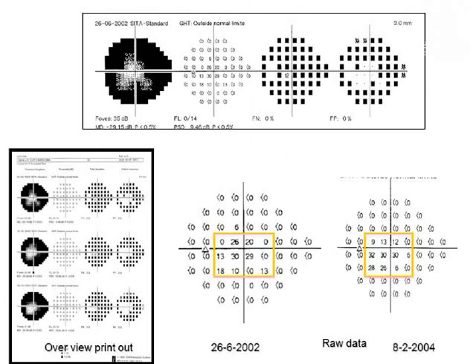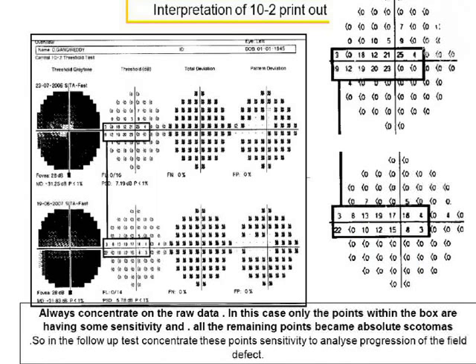See, here all the points are having zeros. Even in 10-2, all the points are. So the retinal sensitivity is confined to these 10 points or 15 points. A change in these points, if you want to express it in mean deviation, will be distributed to all the points and expressed as the average. So in this situation, you only see point to point.